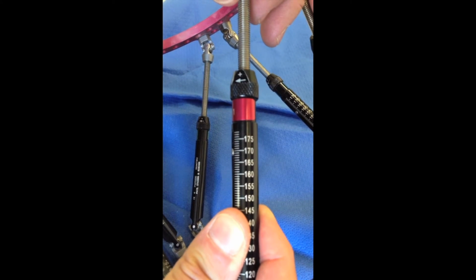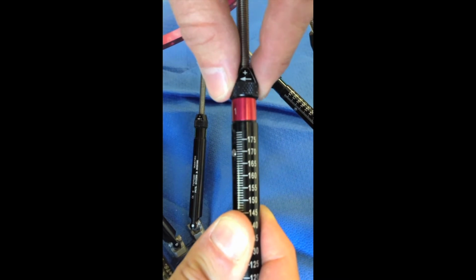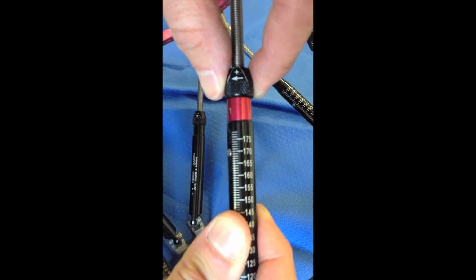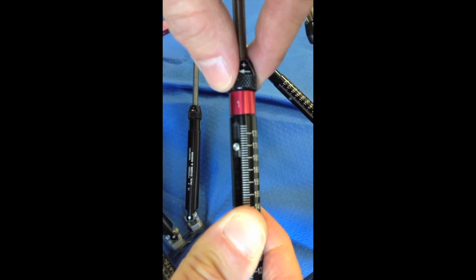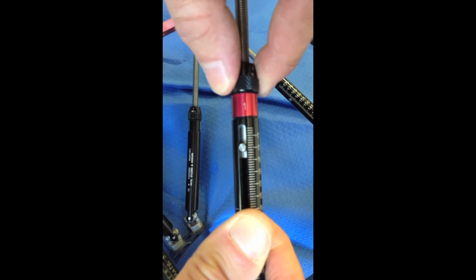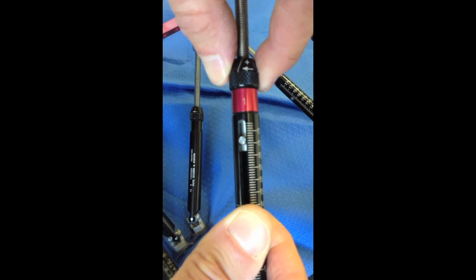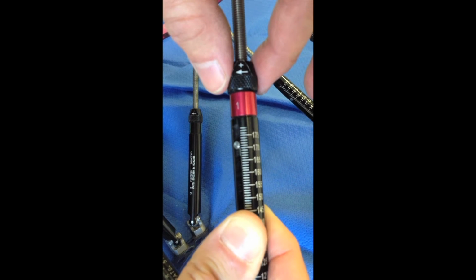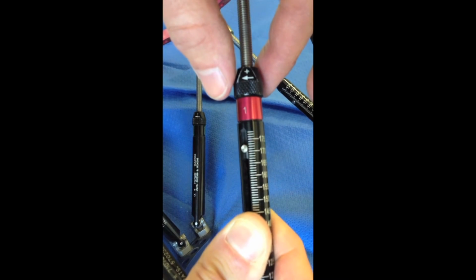With one hand I hold the body of the strut. With the other hand I turn this knob. See, that turns independently. And I turn it in the direction of the arrow, which will make it get longer. So let's watch that bead. I'm turning it in the direction of the arrow until I get to the next notch. The next notch is 171. And that's my adjustment.